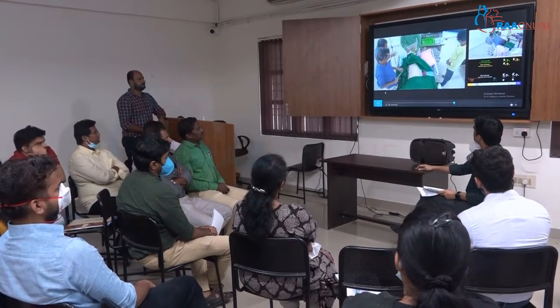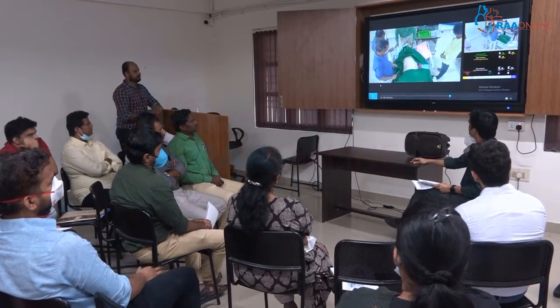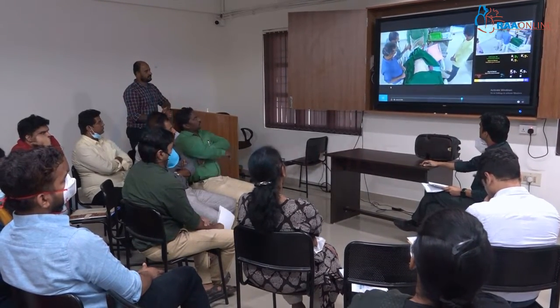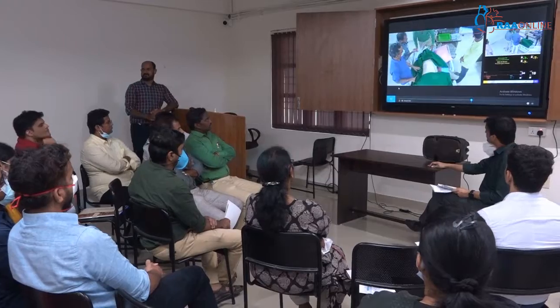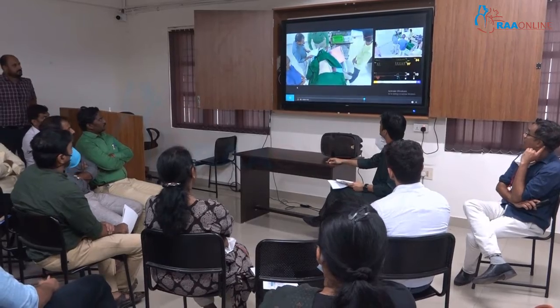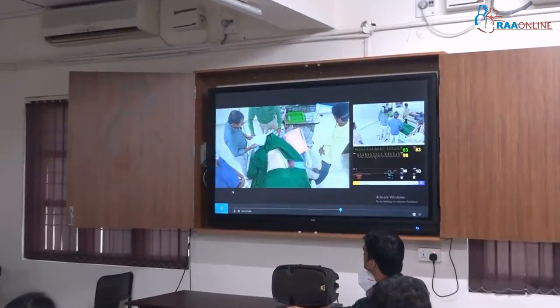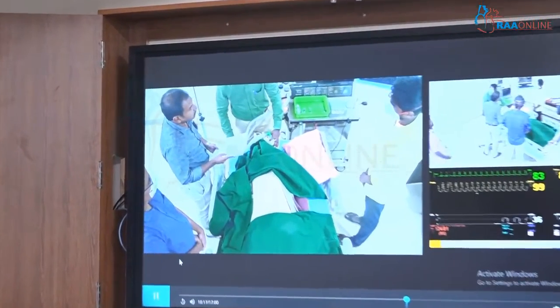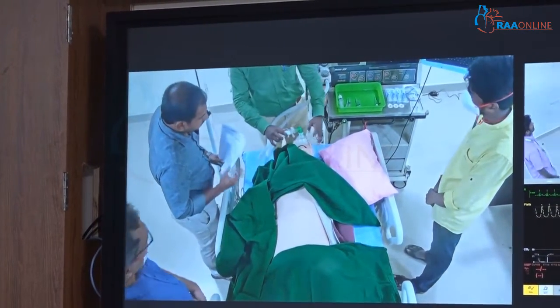Is the consent taken for anesthesia? Yes, sir. Okay. What are the baseline vitals? Show me the baseline vitals. What is his saturation? What is the heart rate? What is the weight of the patient? He is 84 kg, right? So he is obese for his age. Yes, sir. In that case we have to take that concern also. Okay, this is his baseline vitals. Now we will start induction of the patient.